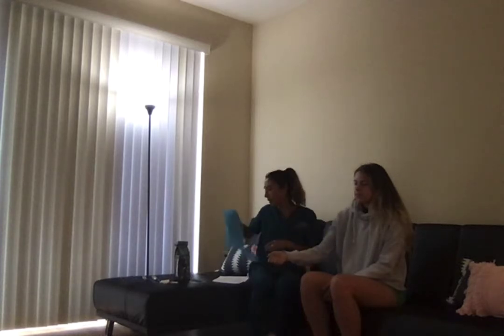And I will take the blood pressure cuff off, and then I will assess for my patient's radial pulse for 1 minute, and the normal finding is that it is 60 to 100 beats per minute. And then I will place my patient's hand over their chest and count for 1 inspiration and 1 expiration as 1 breath, and the normal finding is 12 to 20 breaths per minute.